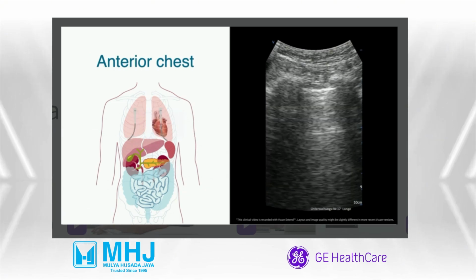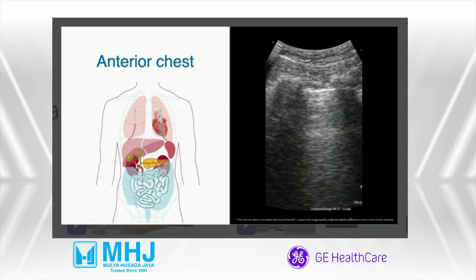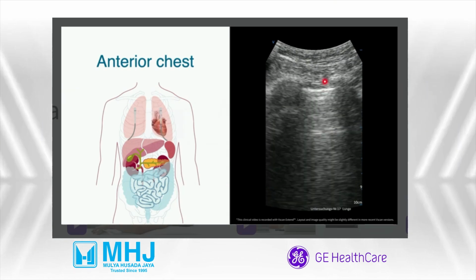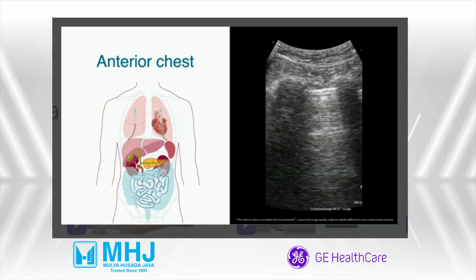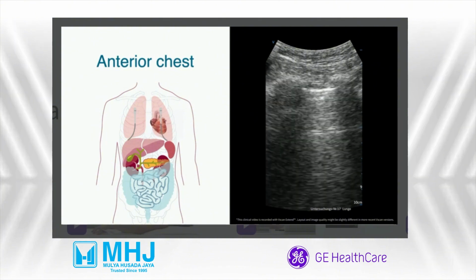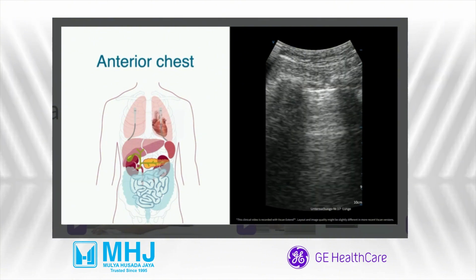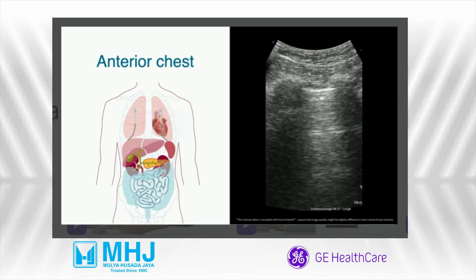You're going to place your transducer into one intercostal space and you want to image between the ribs. So in this image, you can see there's a rib on the left and the right side, and you have the adjacent rib shadow behind that. And below that, you can see the bright pleural line and the pleura sliding nicely when the patient is breathing.